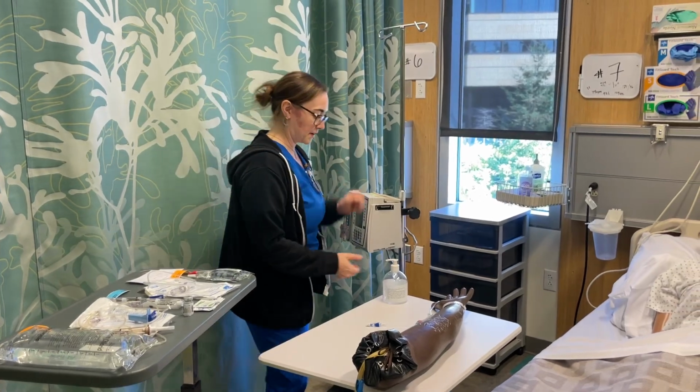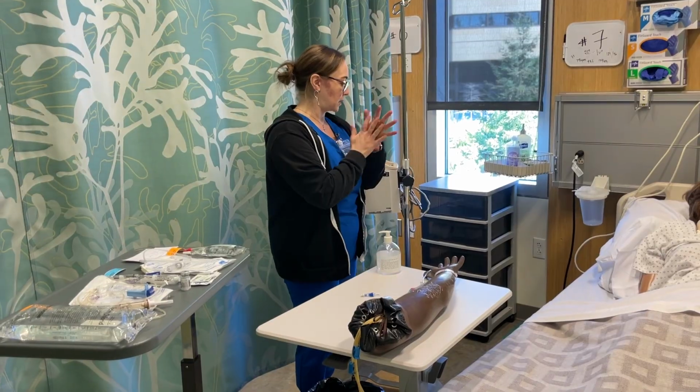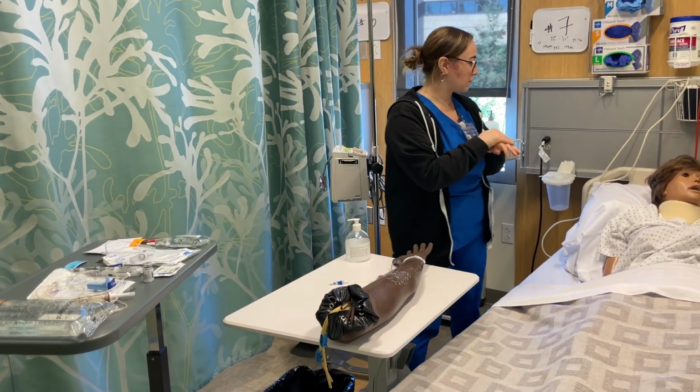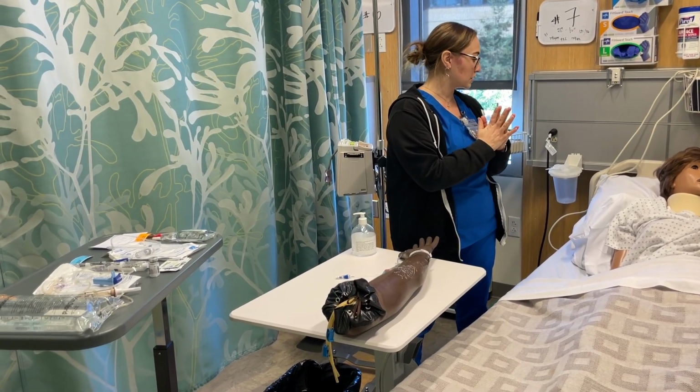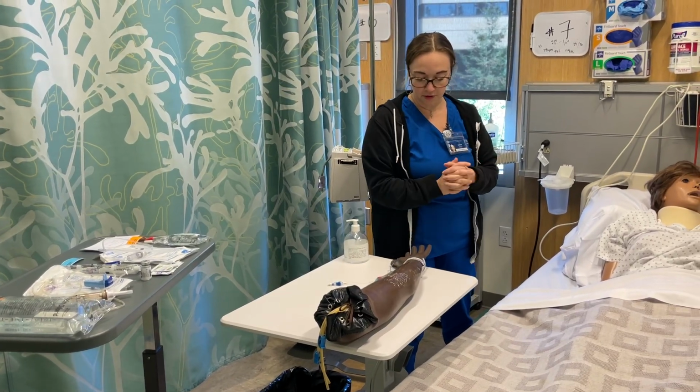Hi, Irina. My name is Jessica. I'm going to be your nurse today. Just doing some hand hygiene. I see you have a couple medications that came through for your UTI. And it looks like last time in your chart. And I'm going to check her name, date of birth. It is her.